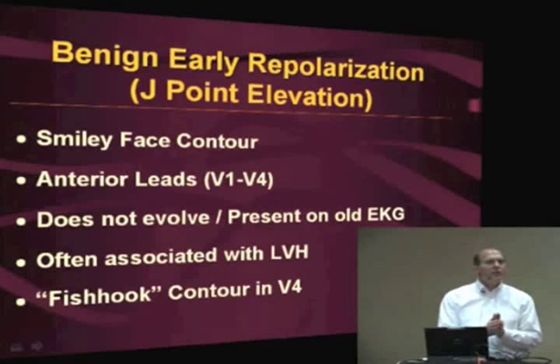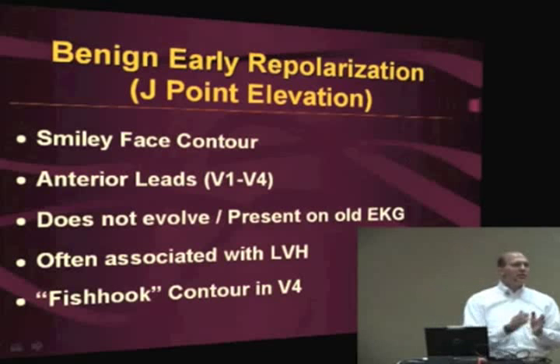It's often associated with LVH. So I think it's useless for us to learn the criteria of LVH for diagnosing LVH, but it's useful to look at the voltage and understand LVH, because if big voltage is there, that can help explain anterior ST elevation. That's another piece of information, okay?